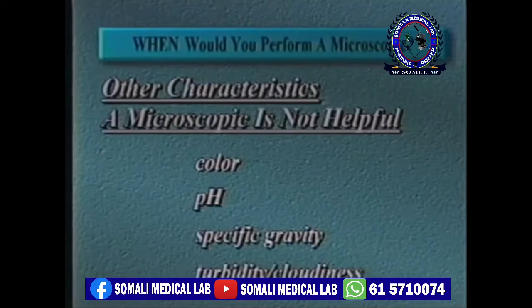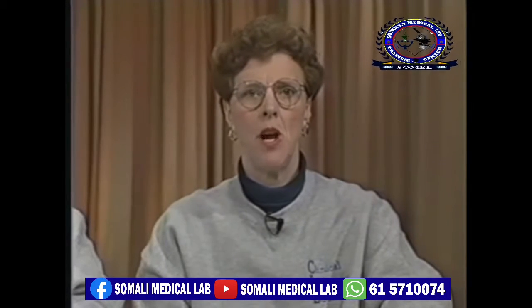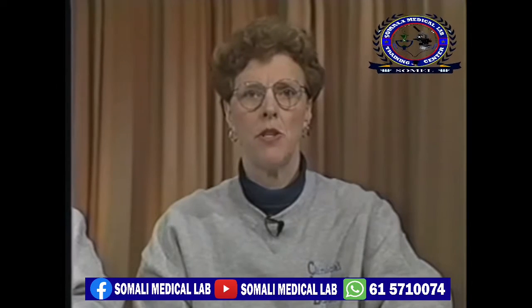The clarity or turbidity of the urine is another issue. Many people perform microscopics on urines with negative chemical screens merely because they're turbid or cloudy. We think you need to evaluate this in your institution for your patient population. In our experience, if the only abnormality is a cloudy urine, the probability of finding clinically significant elements in the microscopic examination is minimal. Now, in the what section, we will do a quick review of the common elements seen on routine microscopic examination of urine.